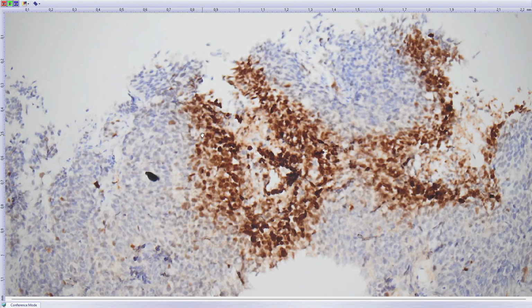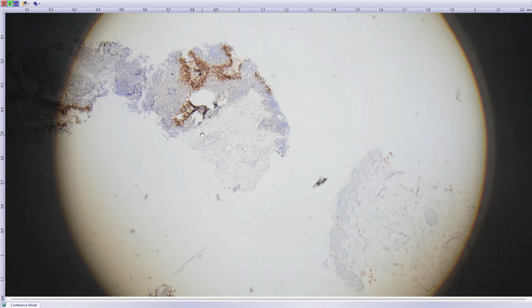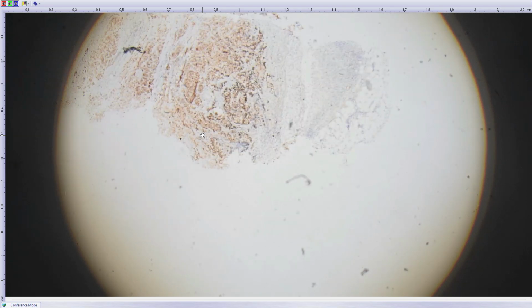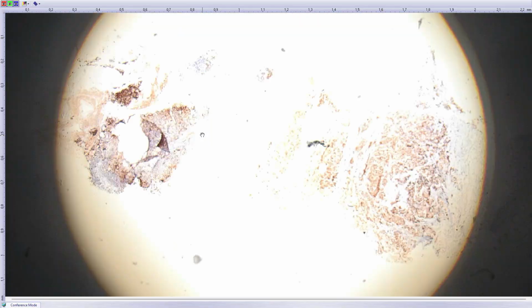It completely loses the myxoid and adipocytic differentiation and becomes basically an undifferentiated small round cell sarcoma. And here we see beautiful multifocal, very strong nuclear expression of DDIT3. Myxoid liposarcomas have the FUS-DDIT3 gene fusion. That's why this antibody is so specific.